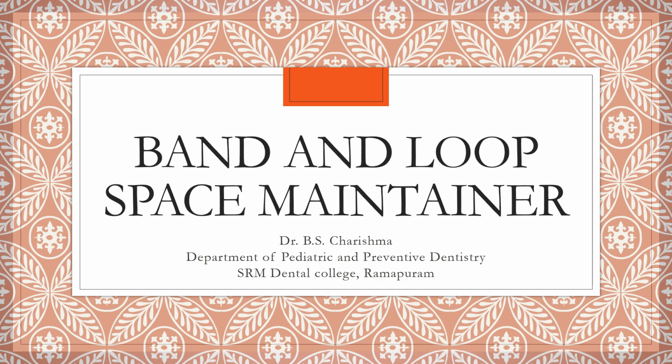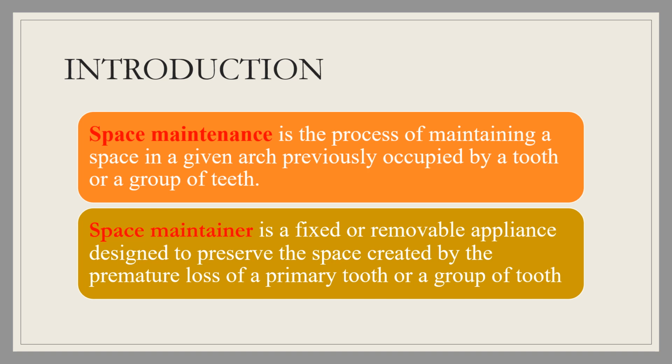This video is about band and loop space maintainer. What is it and how do we fabricate it? Coming to space maintenance, it is the process of maintaining a space in the given arch which was previously occupied by the tooth or a group of teeth.